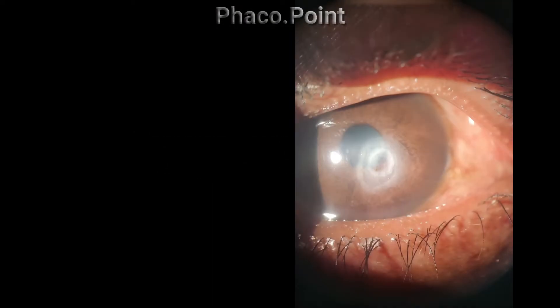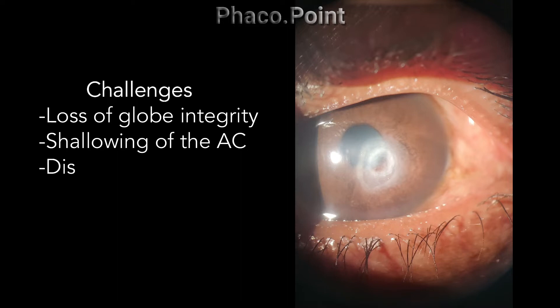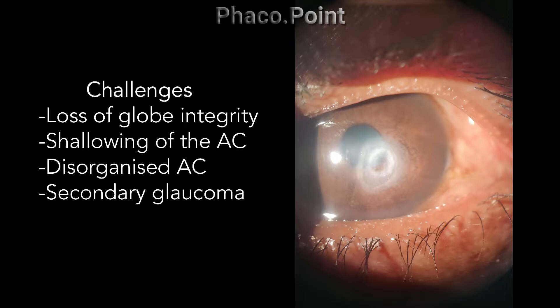A corneal perforation comes with its own level of challenges. Most importantly, you have the loss of globe integrity. It could result in a shallowing of the anterior chamber, an iridocorneal touch, a disorganized anterior chamber as you can see, a secondary glaucoma, and of course a significantly increased risk of endophthalmitis.